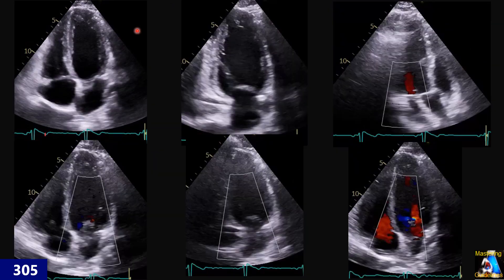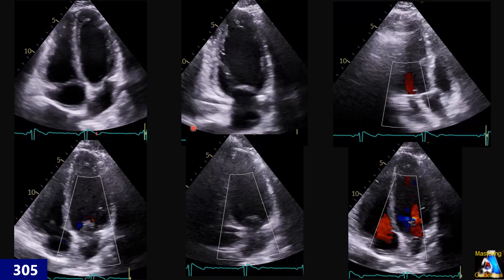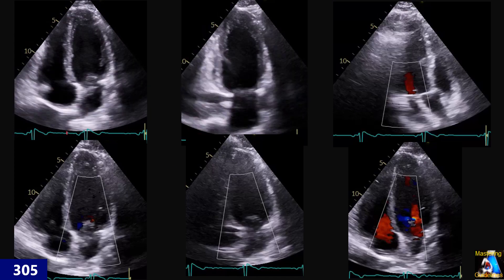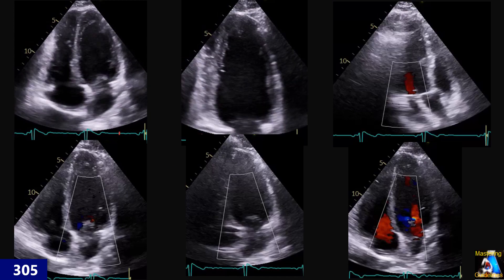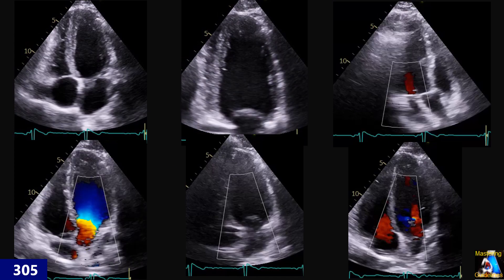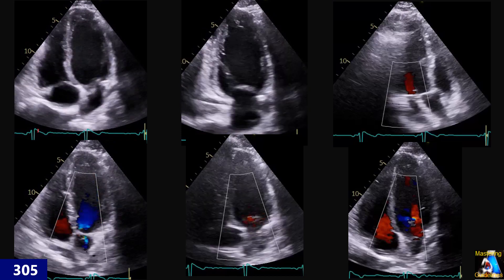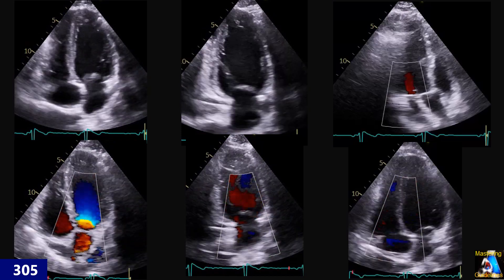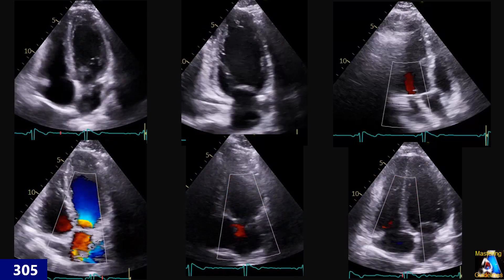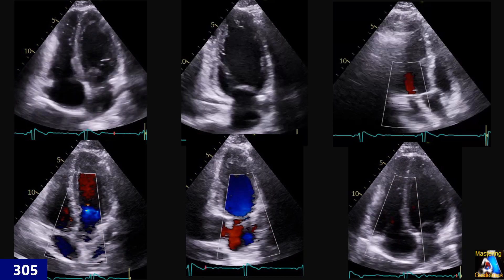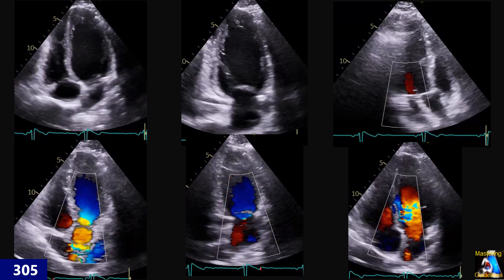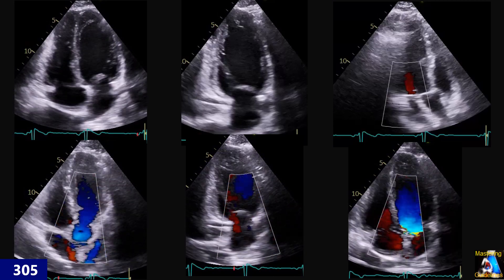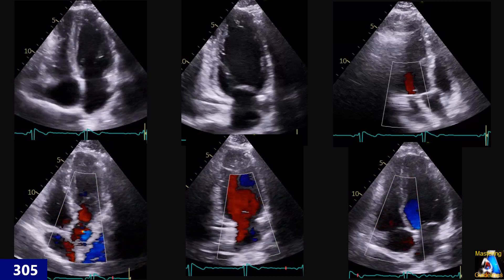Here we have the apical window. As you can see, apical 4-chamber, 2-chamber, and 3-chamber with color, 5-chamber, 2-chamber — all those views that we needed on color and non-color 2D imaging.